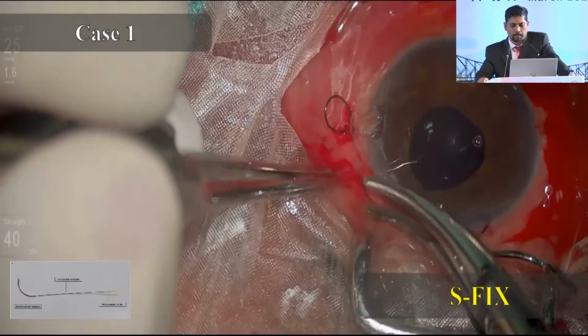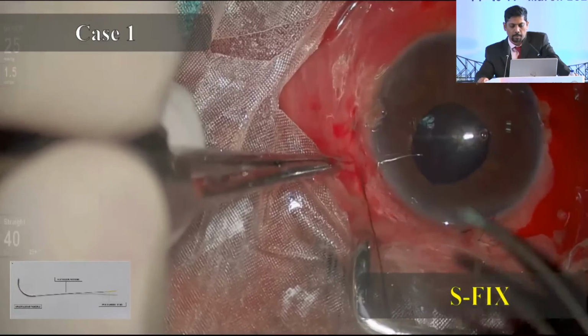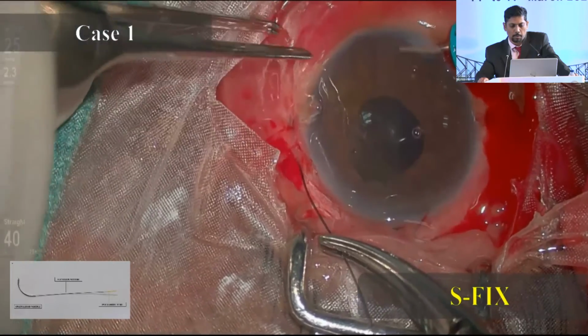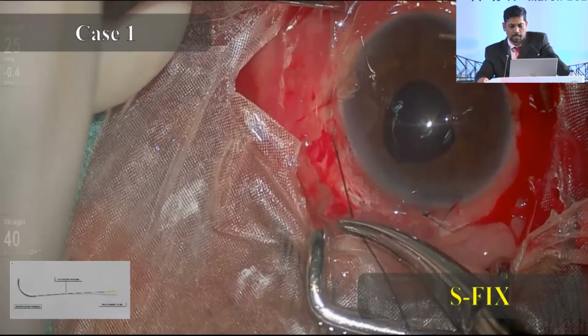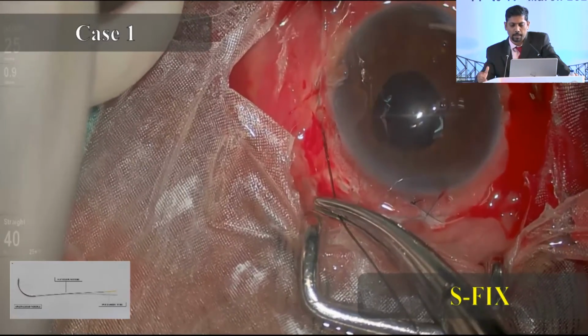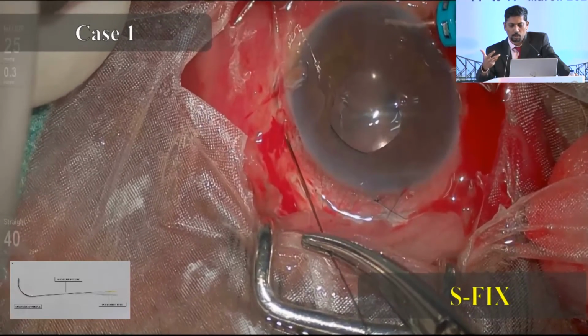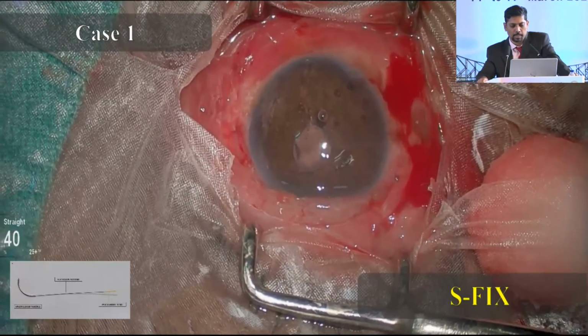Retract the suture thread. As you can see here, the thread comes out. The polyamide tube will also come out, but the suture gets fixed. You'll see that shortly. You can see the IOL movement of the optic inside, put retro and then visualize. Be convinced that the optic goes inside and the suture, you can see the blue optic gets fixed inside.